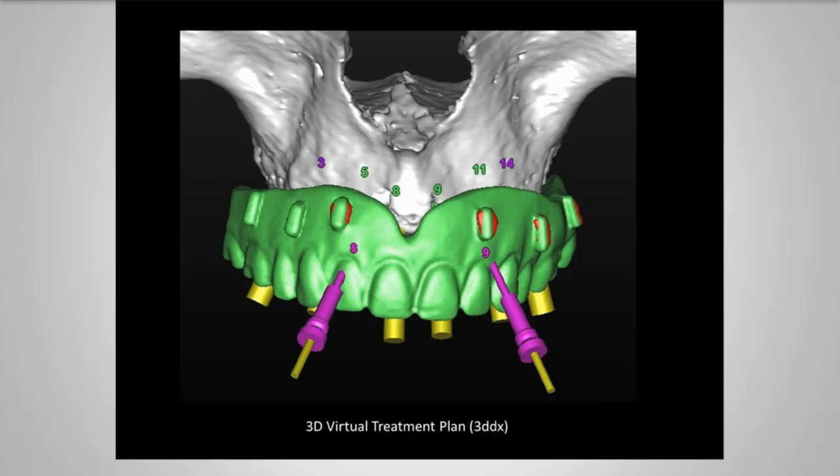We went ahead and sutured this patient and delivered the immediate denture. Again, relining this with the UFI Gel from Voco America. Four months after extractions, we see that the ridge has healed very nicely.